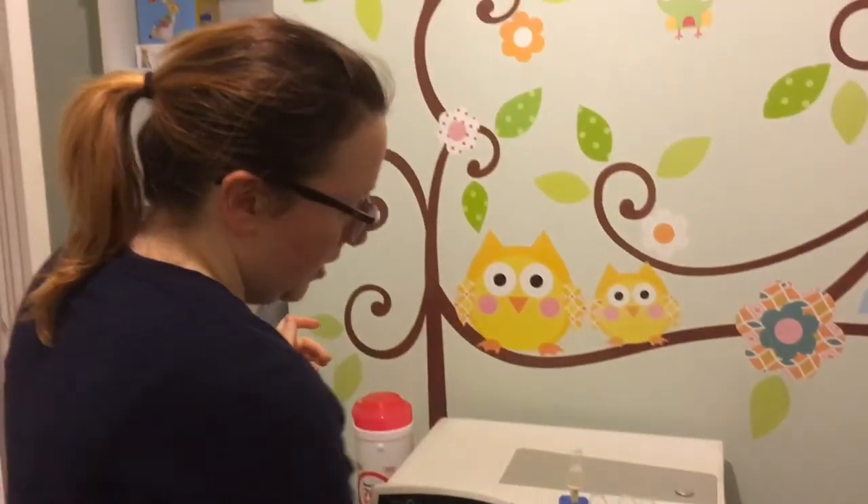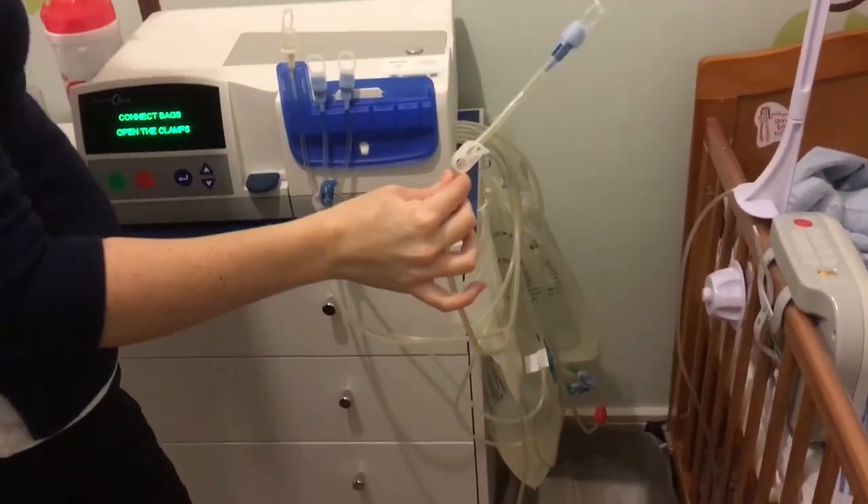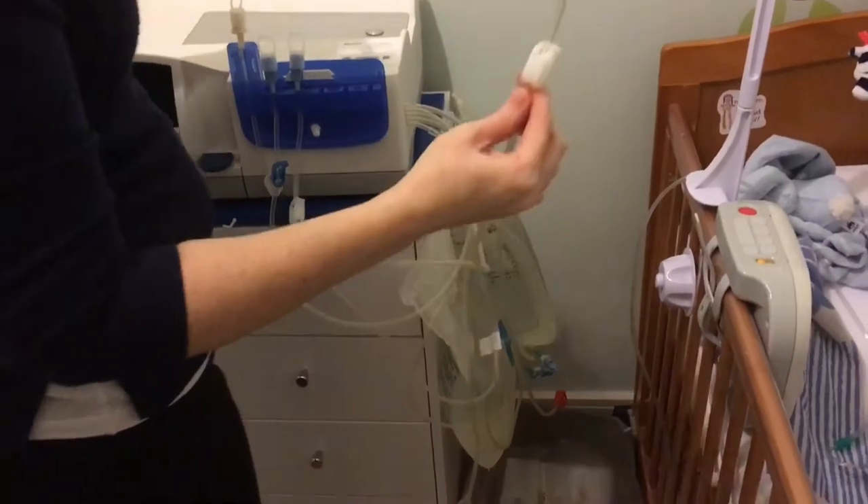White one's next — that's going on the other weak bag. So after the red bag is empty at the top, it pulls fluid from this one.